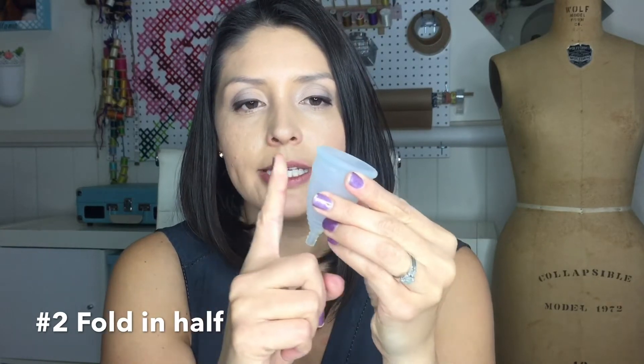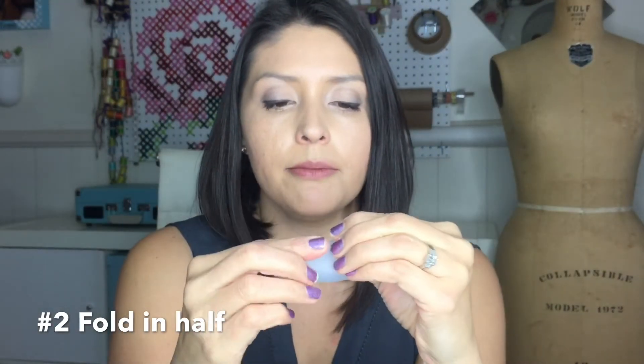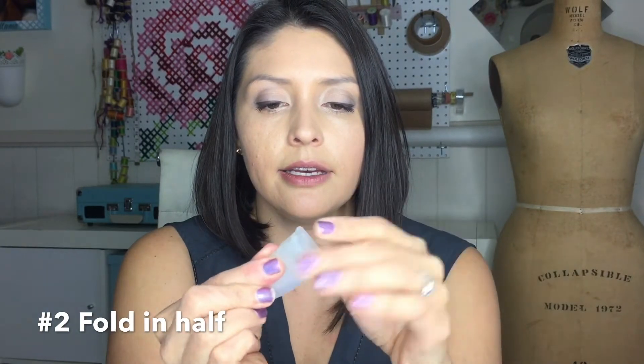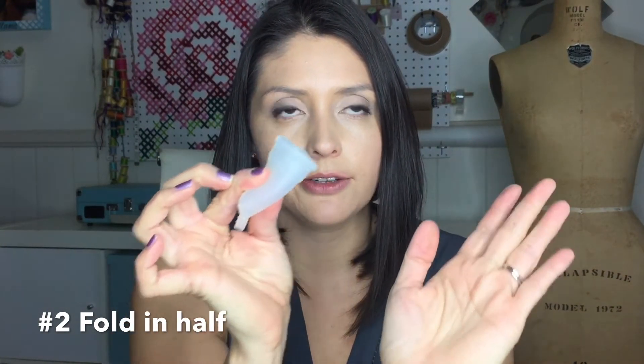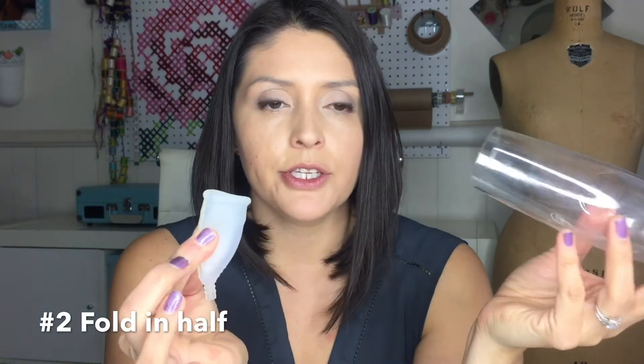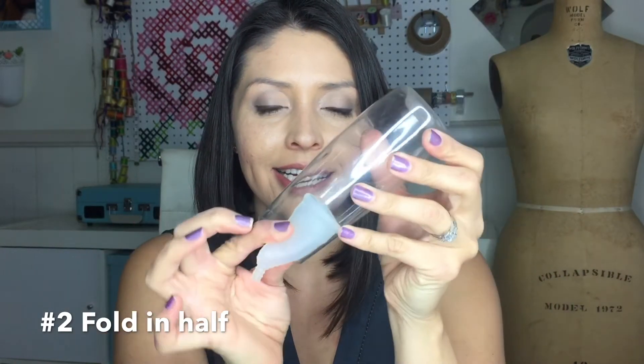The second method you can use to insert your menstrual cup is the fold. You basically fold it down the center with your finger so it's completely folded. I don't find this one as easy for me because I have a tilted pelvis, so it's harder for me. But whatever works for you — go ahead and do your wide sumo squat and bear down while you're inserting.